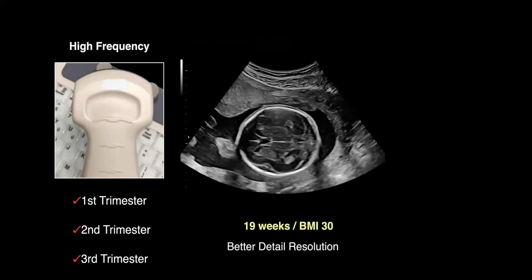All transducers have different operating frequencies and capabilities. High frequency transducers produce better detail resolution, but of course with limited sound penetration. Here you can see an example of a high frequency transducer. This is certainly helpful for evaluating the first trimester, the second trimester, and even the third trimester. I always try to encourage my sonographers to start off with your high frequency transducer, make that your workhorse probe, and obviously if imaging is subpar, then you want to move on to your low frequency.